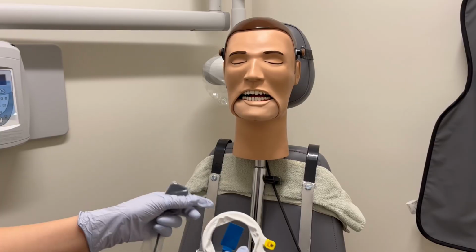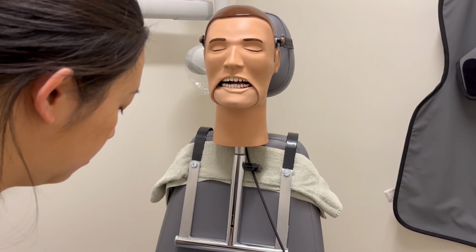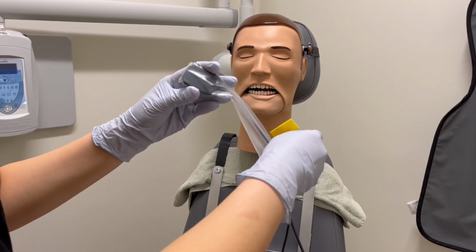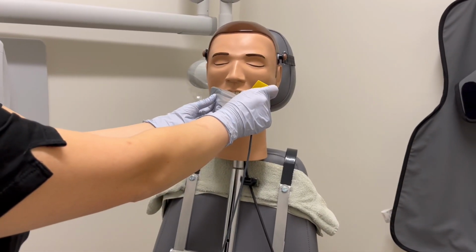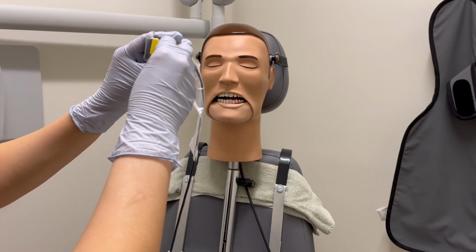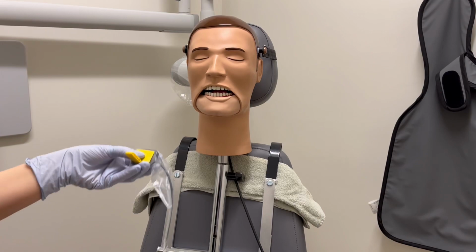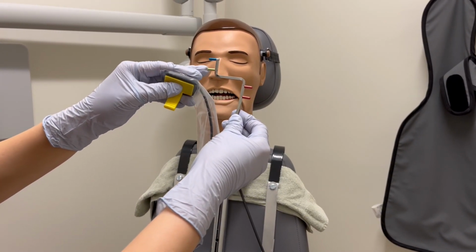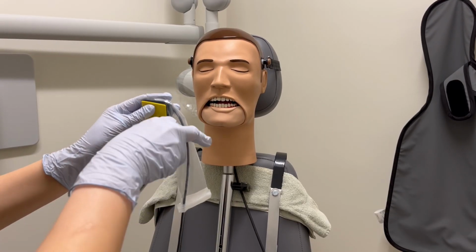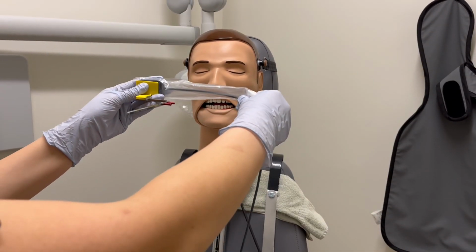Next, posterior PAs. If it's for the upper right, cord is coming out of your patient's mouth. Place the yellow bite block on. The indicator arm, we're going to then attach the yellow prong into the bite block. The indicator arm should be outside of the patient's mouth as well.